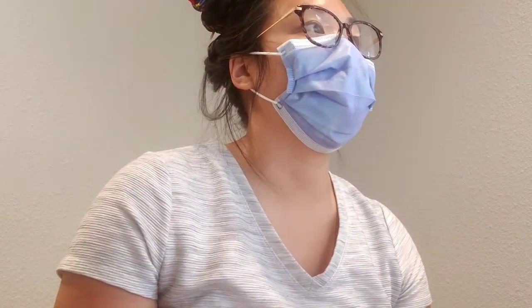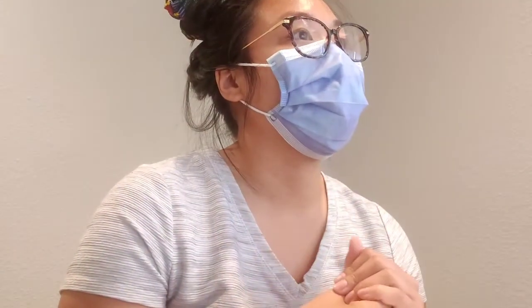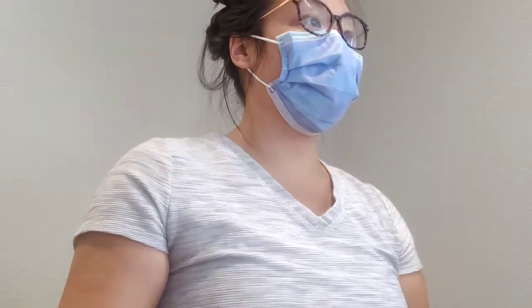Number 4, the optimum enhancement of blood vessels and organs on a routine abdomen pelvis CT scan. The average adult patient should receive blank milliliters of IV contrast. It says 100 to 150, because this one bottle is about 100 milliliters. And that's what I answered. Normally I would give less, because I don't want to give too many patients a lot of contrast because of the kidney. You don't want to mess up someone's kidney because it's very dense and concentrated, and you want them to filter it, especially if they have underlying diseases. But the answer is 100 to 150 for an average patient to see blood vessels and routine organs.